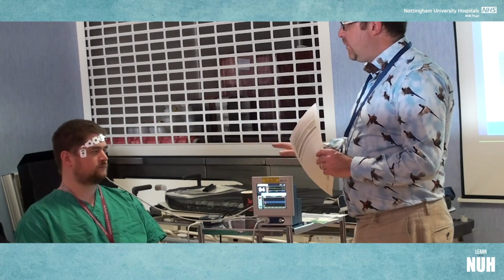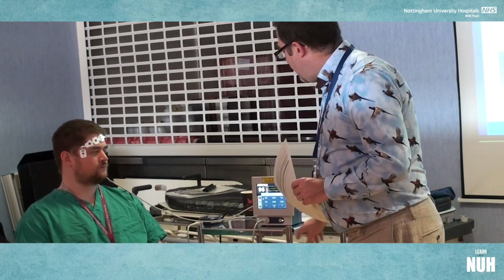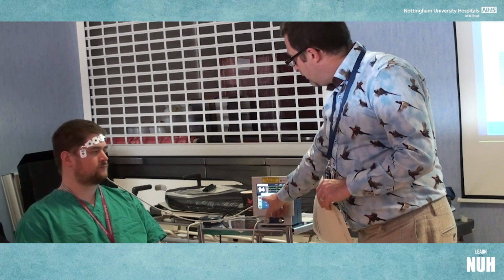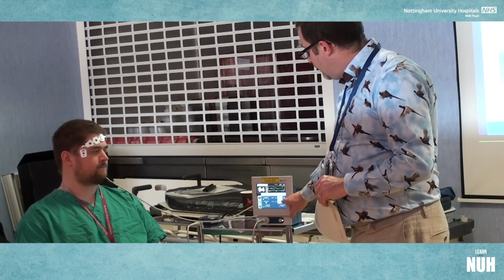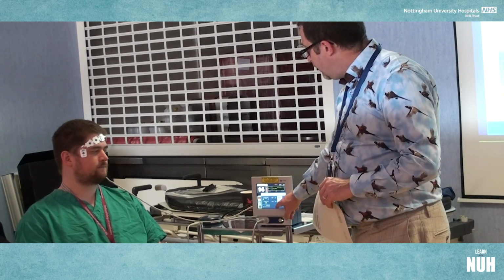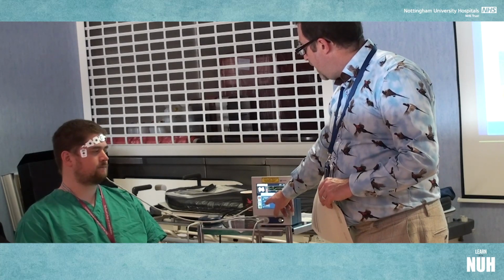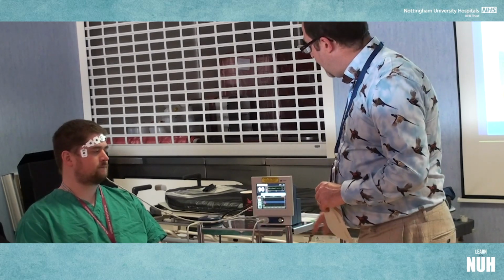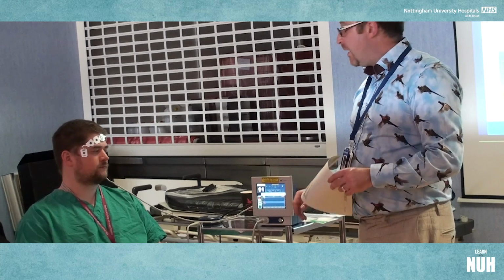What we might want to do is change some of the settings, so we'll go over the more common ones there. So in terms of the menu, what we might want to do is set a target range or a band to operate in. So in the top left hand button, we press the target range, we can see we can set a low and a high, we can increase or decrease that range, switch it on the left hand side, on or off, and then choose whether we want an alarm or not, and always exit the menu by pressing the little home key. So this blue band here is what we're aiming for. If the propofol's going on the floor and the BIS rises, we'll get an audible alarm.